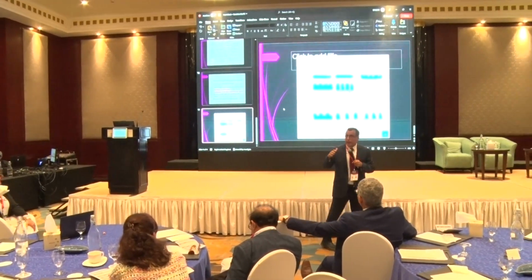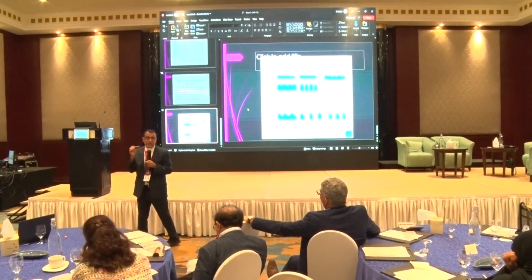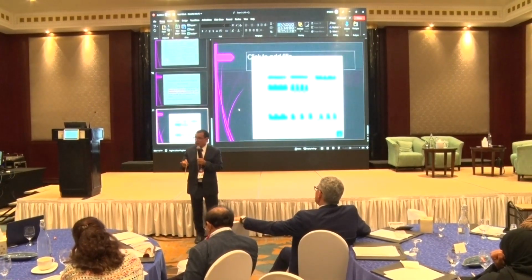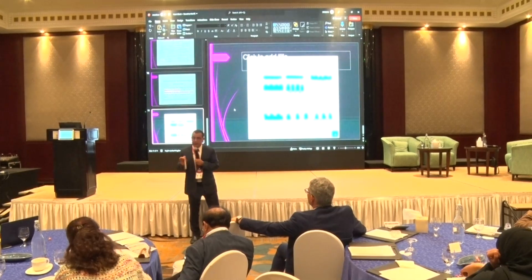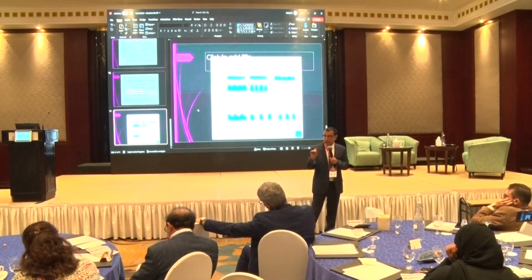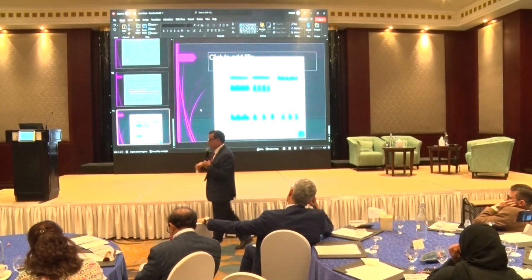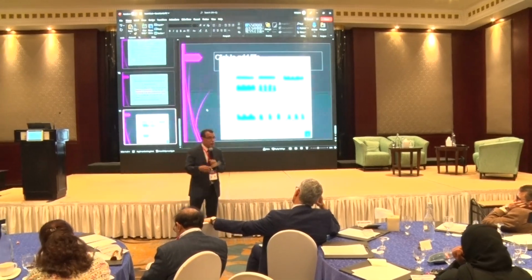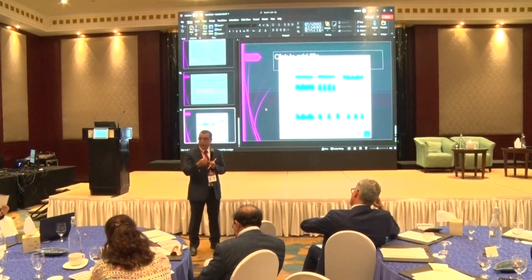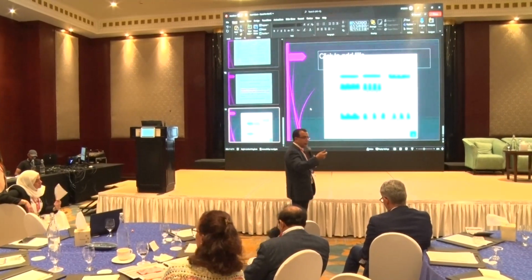Heart block, if you suspect it, let's say a patient with lupus, they are susceptible to heart block. If they have the first child, then you should scan them on a weekly basis starting at 16 weeks or sometimes earlier, and you should be very careful when you do the PW from the mitral and aorta, and start to detect the possibility of developing heart block. It will not develop third degree from the first day. It will start first, second, and then third.